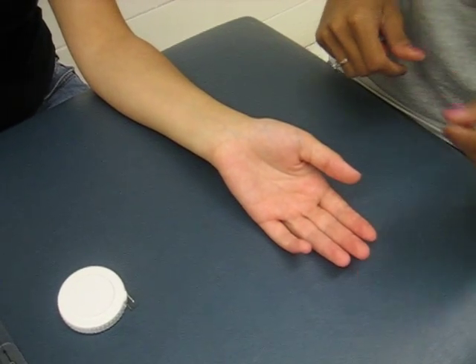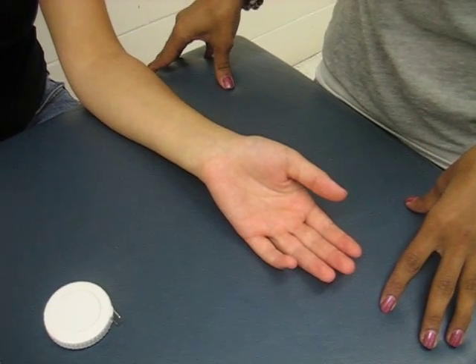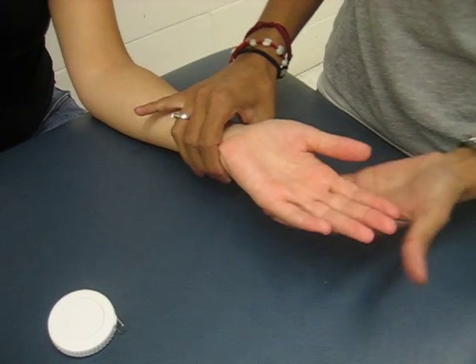Now we're going to move on to thumb CMC opposition. We're going to have the patient sitting down with the dorsal forearm resting on the plinth.